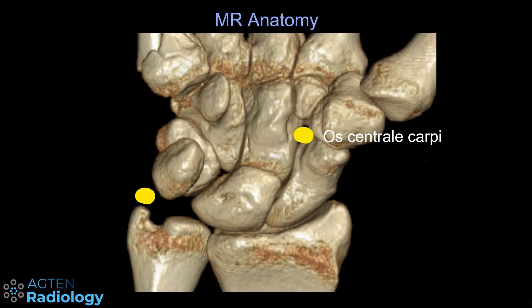Ossicles above the tip of the ulnar styloid can either be an accessory ossicle named the lunula, or also a pseudoarthrosis after an ulnar tip fracture. If the ossicle is located more medially within the TFC, then it's called the os triangulare.